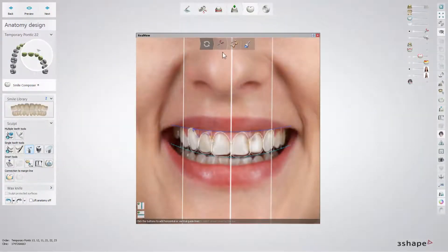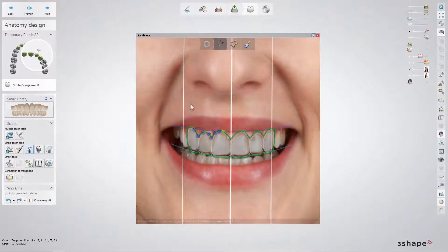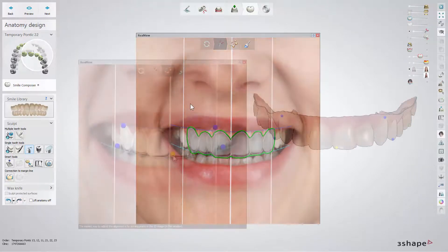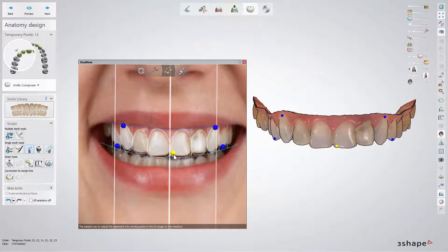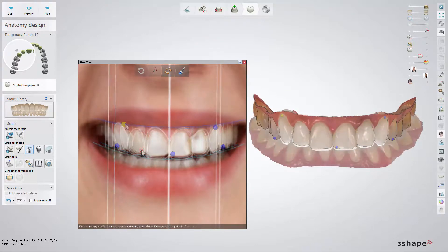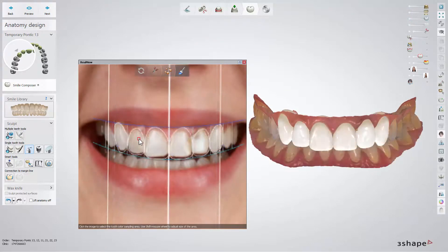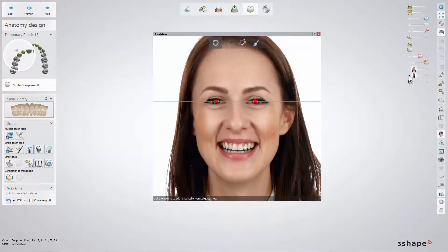Set the cut-out line where the design needs to be visible through the photo. Place reference points on both the picture and the scan to align them together. Adjust the shade of the teeth, then align the photo. It is important that the two photos are aligned in the same way in order to compare and assess the design.